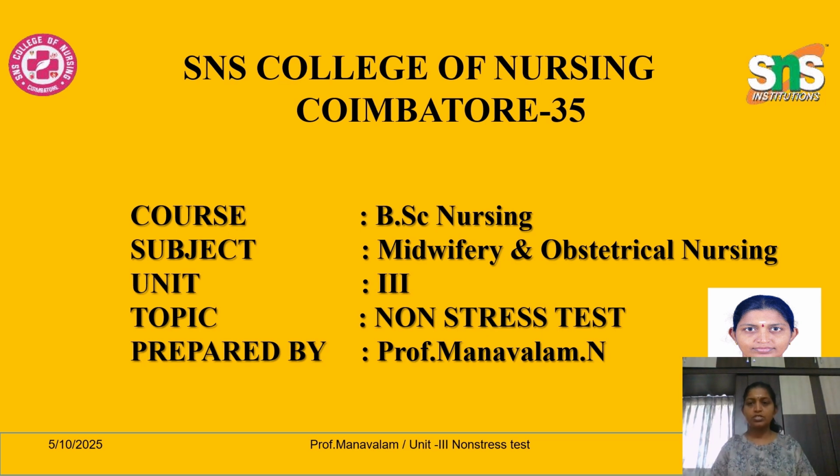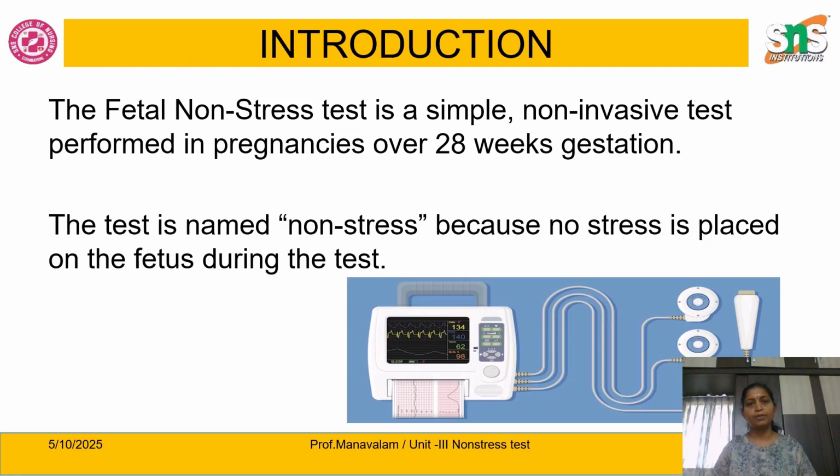It is a painless procedure, it is non-invasive, and there is no need to spend much time in hospital settings. It is like an OPD procedure. They can come and do this procedure and go. It is simple to do, and the interpretation is very easy. We can find out complications early, and by doing this test we can take the necessary intervention to prevent further complications. Let us see about the non-stress test in detail.